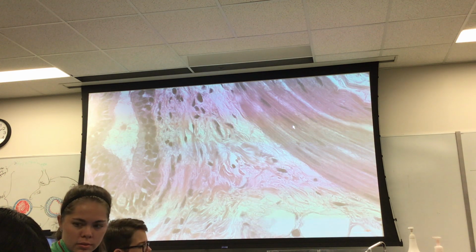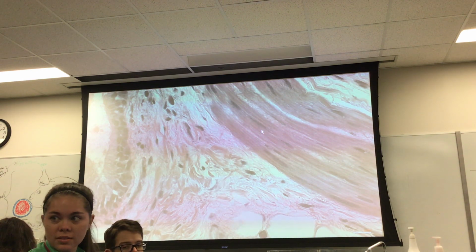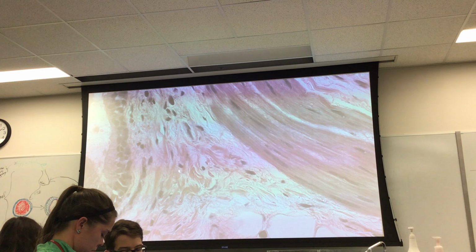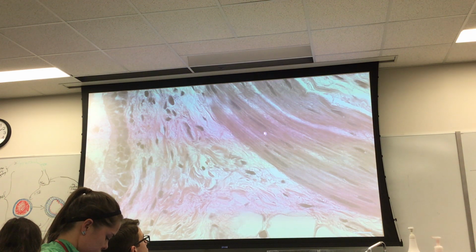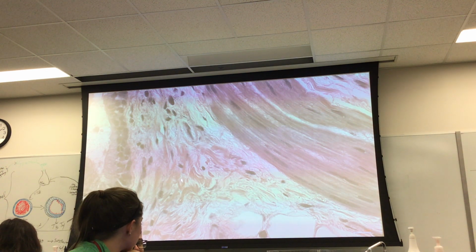Now, what kind of cell is that right there? Is that a fibroblast? No, that's a smooth muscle cell. Are these guys fibroblasts? Yes. So the point is, be careful about, look for the staining differences. So this is smooth muscle, this is dense, irregular connective tissue.